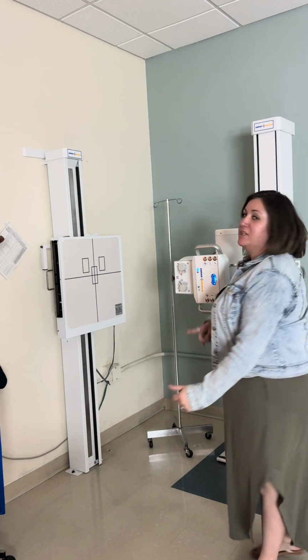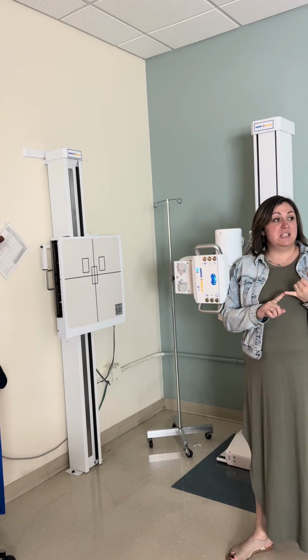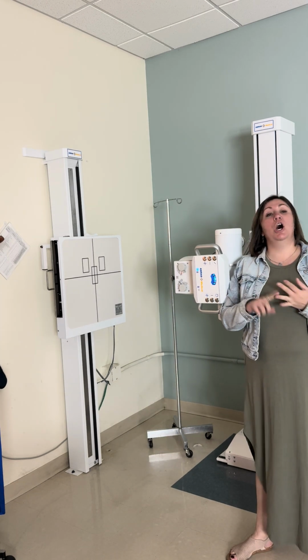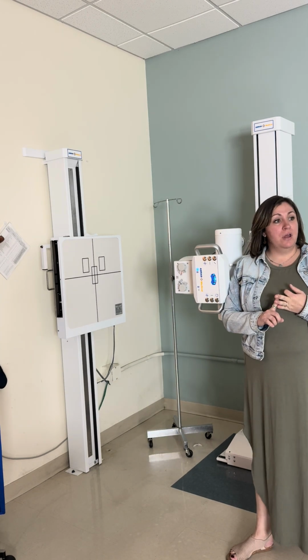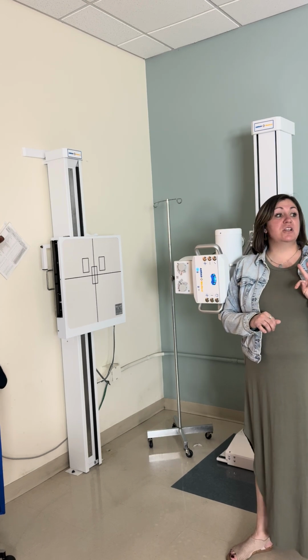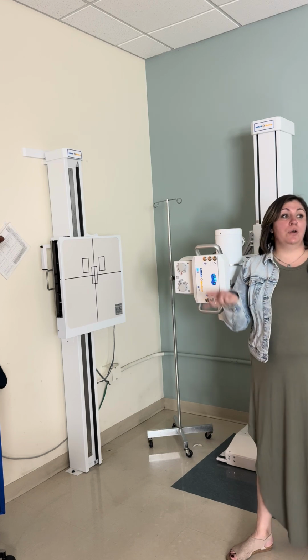Okay, so today we're going to be doing C-spine and T-spine. For the C-spine for practicum, we're gonna do AP, axial, open mouth, and then lateral. I'll go over the obliques of the C-spine and then the flexion and extension views as well, because you will use those frequently in the real world.